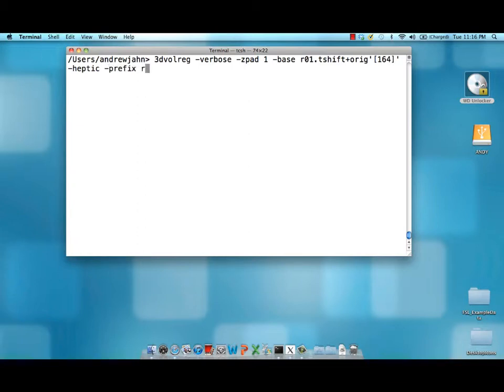There's going to be a prefix for this data set. I'm going to call it r01 underscore mc for motion corrected.